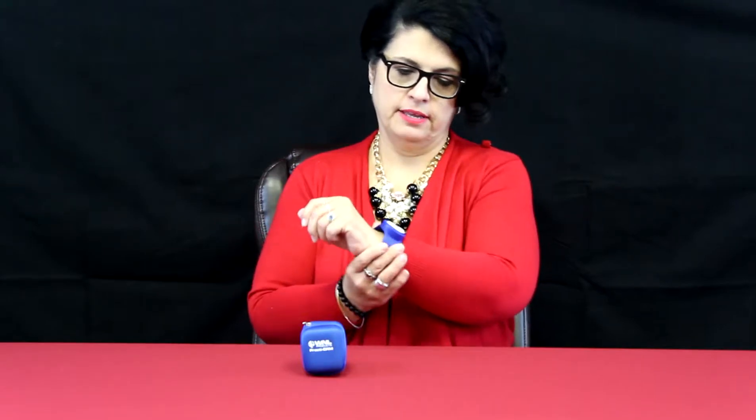Just open it up and it is almost exactly like those slap bracelets that we used to have, or some still may have. Just slaps on like that.